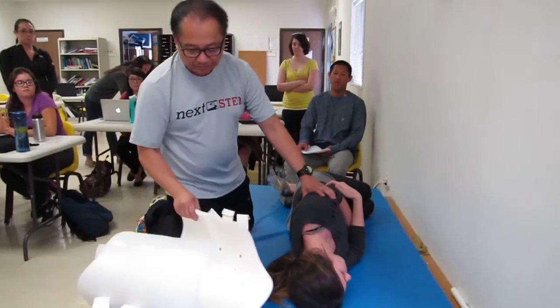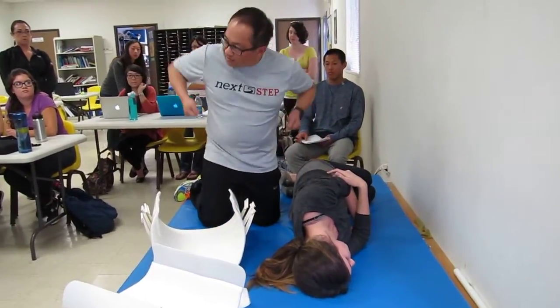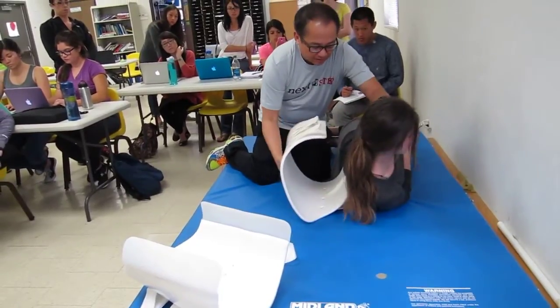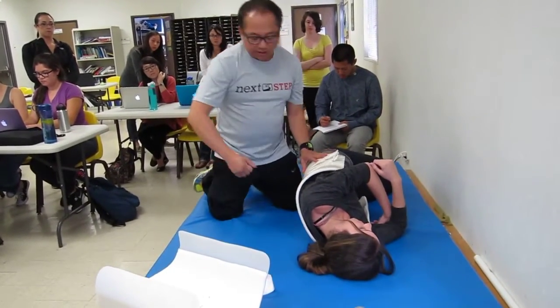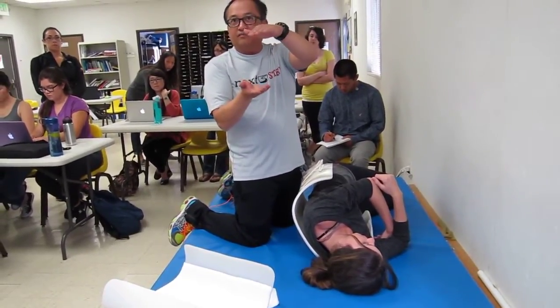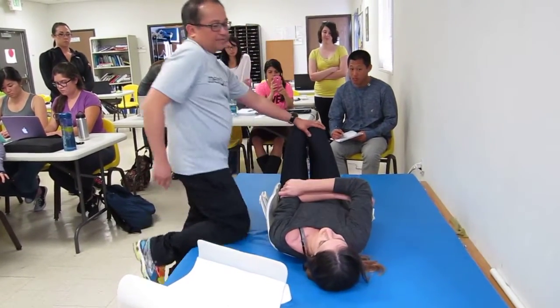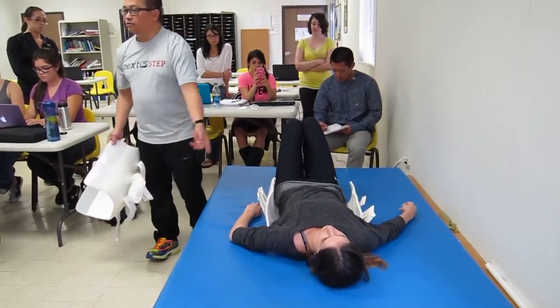Good. Now, the bed has a lot more give than this, so you can just push it underneath Megan's torso at this point, but I don't want to hurt Megan, so Megan, can you lift up a little bit? There you go. You can just push it underneath her here, because the bed has probably 8 inches of give as opposed to this, which doesn't have any. Then I'm going to roll Megan back to supine. Questions about that?